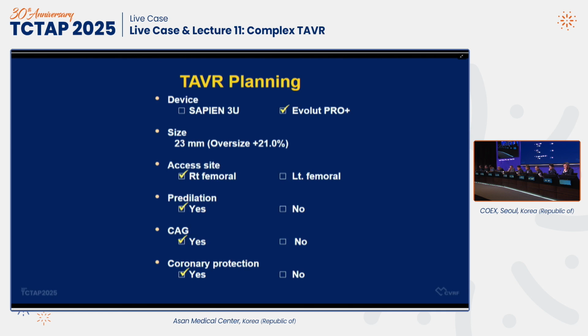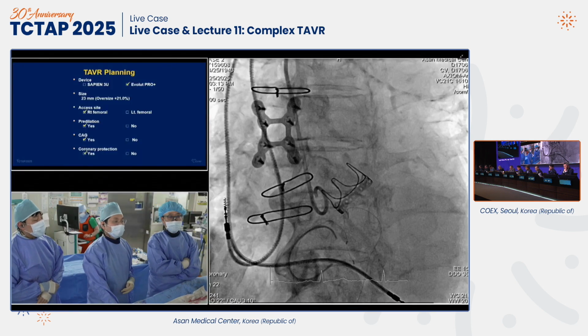Yeah, so this patient is a really complex case.